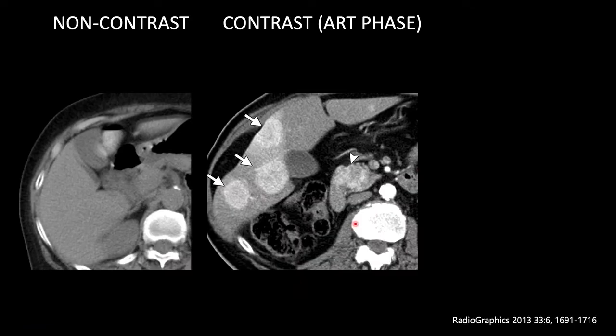Take this example, taken in the arterial phase. Notice that the aorta is very enhanced. There are intensely enhancing lesions in the right lobe of the liver which are very obvious against the background liver, which is not yet at its peak enhancement.